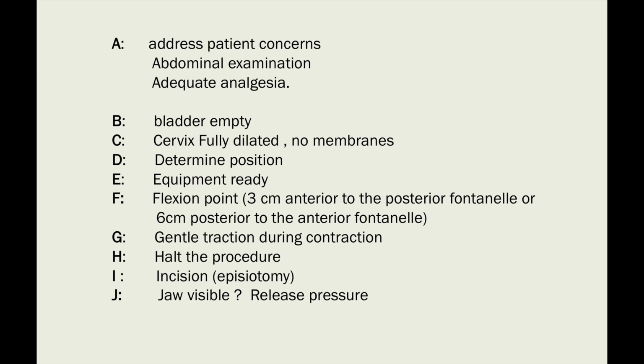So I put the thumb on the cup against the head, and the index finger to support the head, and this counteracts my pulling effect. Okay, and if we have no progress for 20 minutes, or if we had 3 pulls and no delivery happens, so these are the 3 situations when we need to say no, it is not successful.